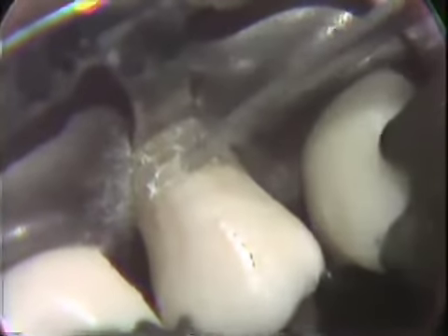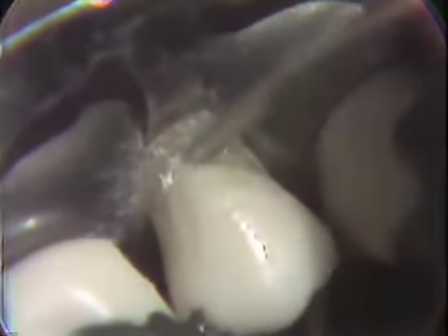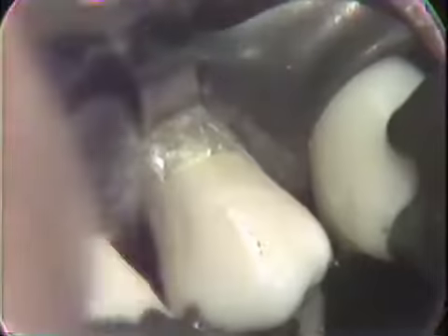Now we'll move down to planing of the occlusal wall. Here again is our major enamel wall. Indeed, we wish to have enamel rod direction being paralleled here.